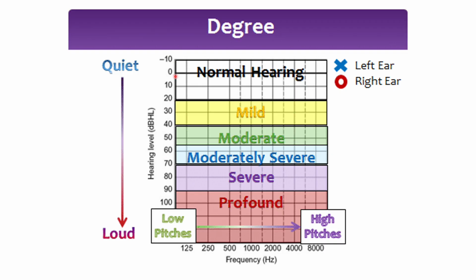At the very top, 0 to 20 decibels, which is the normal hearing range. Below that is 20 to 40 decibels, which is mild hearing loss, where soft sound or distant speech may be hard to catch. Then from 41 to 55 decibels, it is moderate hearing loss, where everyday conversation becomes difficult without hearing aids. Then from 56 to 70 decibels, this is moderately severe hearing loss, meaning normal speech is often missed.